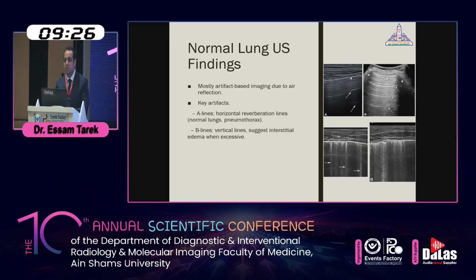Most radiologists say the cut number is 3. As you can see here, we have 3 longitudinal lines, which is normal. So if we have 3 or less, this is a normal finding. If we have more, then we have to subdivide: either it's localized or diffuse.